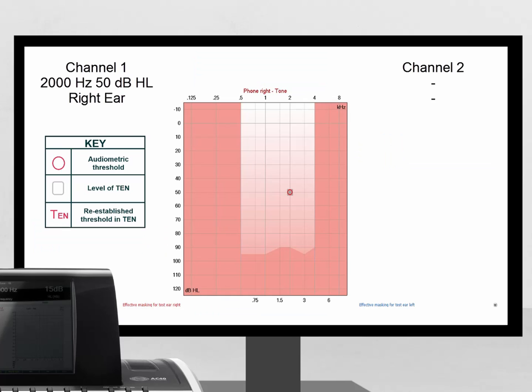Here is an example where a dead region is present. Notice the audiometric threshold of 50 dB at 2000 Hz. You can also see by the dial setting that the TEN has been introduced to the test at 70 dB. Now notice that the threshold in the TEN is 82 dB.